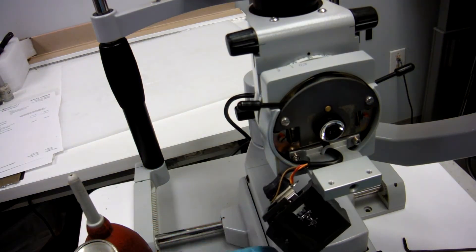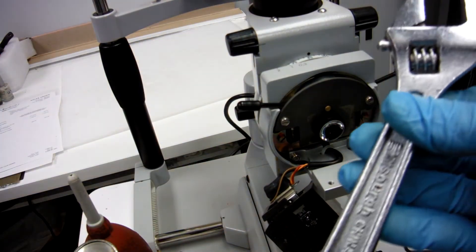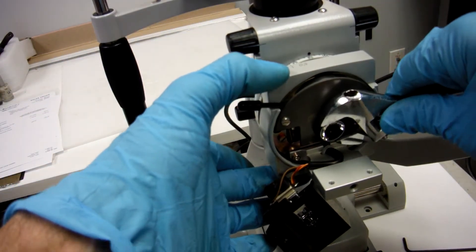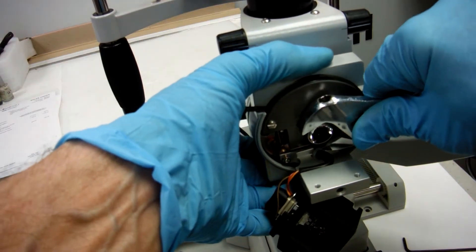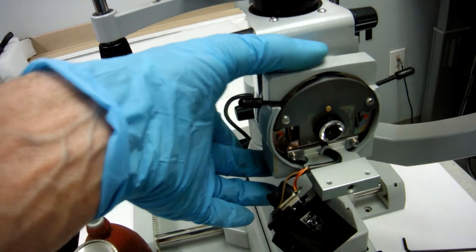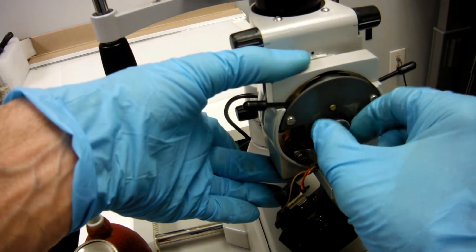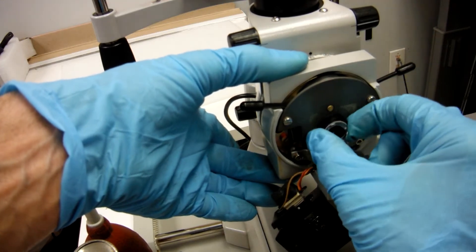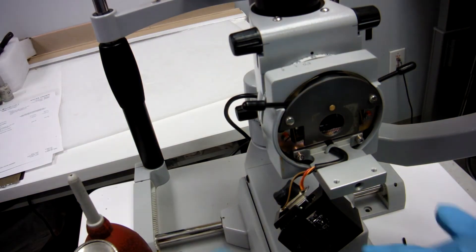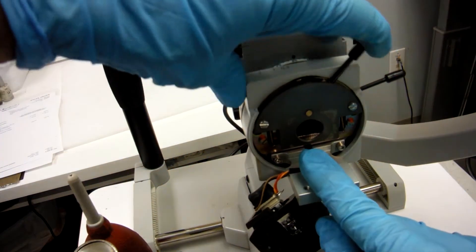Move your light assembly so you can get to your condensing lens. Get a small crescent wrench and unscrew your condensing lens — then you have access to your diaphragm apertures.